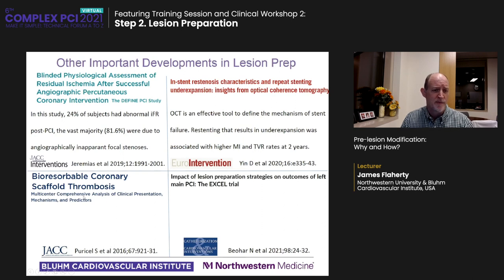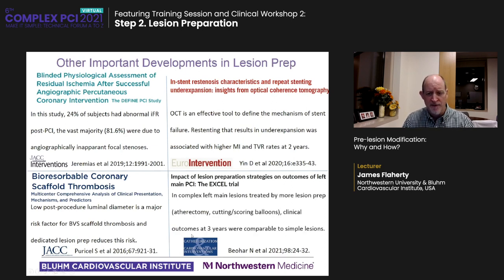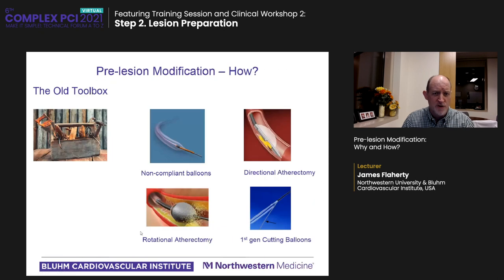What about bioabsorbable vascular scaffolds? Well, we learned that post-procedural luminal diameter was a major predictor of late BVS scaffold thrombosis, and that a dedicated strategy to prep lesions reduced this risk. And finally, here's a sub-study of the EXCEL left main PCI trial. In this analysis, they showed that very complex lesions, when prepped appropriately with tools like atherectomy and cutting or scoring balloons, had similar clinical outcomes as patients with very simple lesions. So not a lot of evidence, but all the evidence points to the value of lesion preparation.